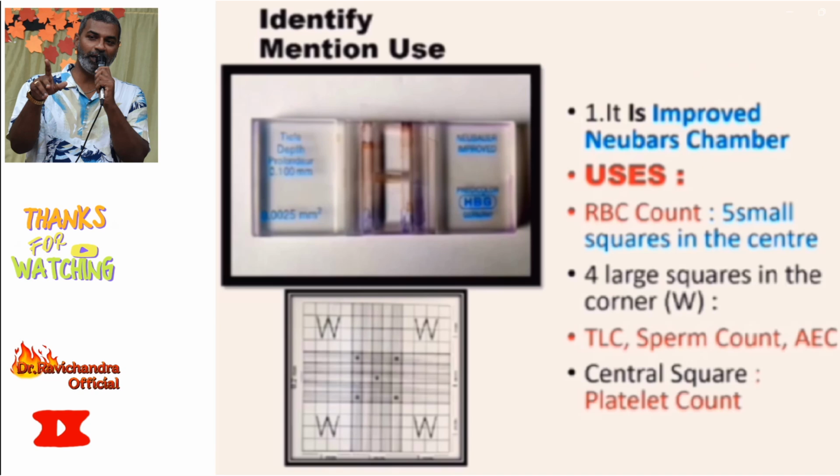Improved Neubauer chamber. Uses are it is used to measure the RBC count, WBC count, sperm count, and absolute eosinophil count. And it is also useful to measure the platelet count also.